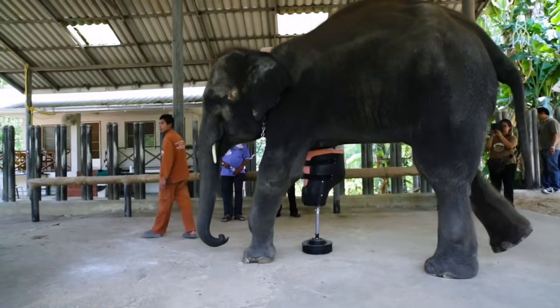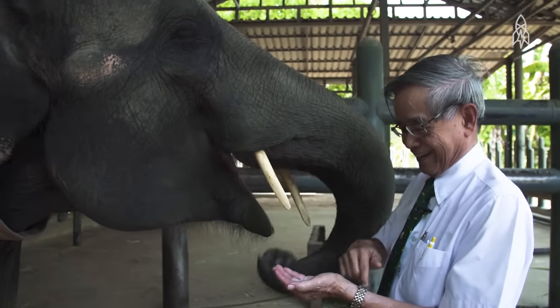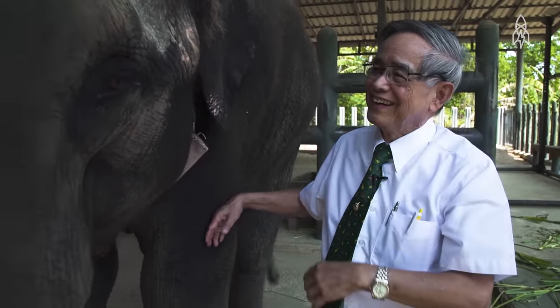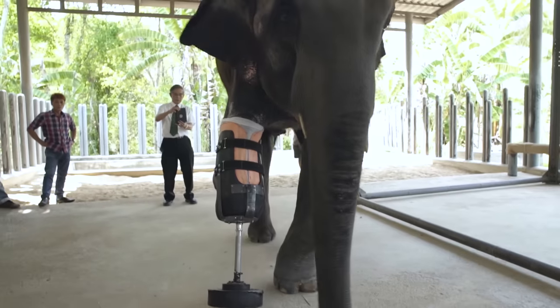This is a challenge for me too. Every time we fix it, we improve it — it's more sturdy, stronger. Sometimes it's in the textbook, sometimes try and error. When she obeyed us, we give her candy, and she knows where the candy is — she used her trunk to go into the pocket. I did an operation on her foot about 15 years ago, but she remembered me. She liked to come closer to me and showed a sign of salute or happiness. I think it means so much for her. She can lead a normal life as she should be.